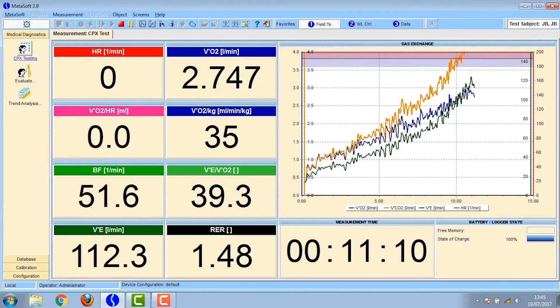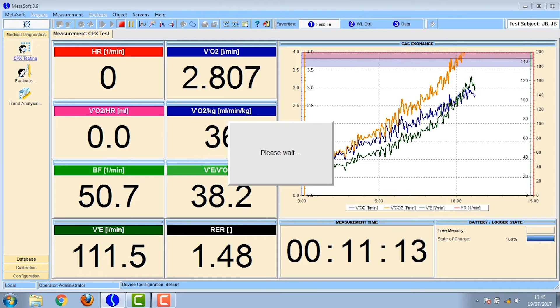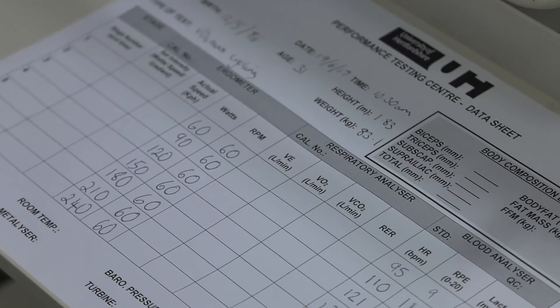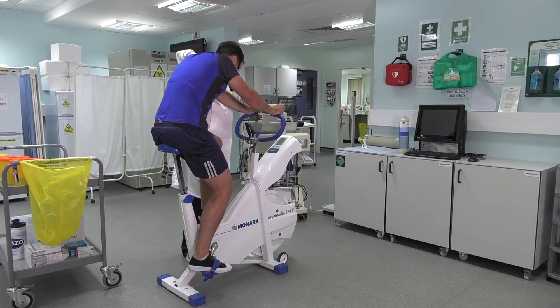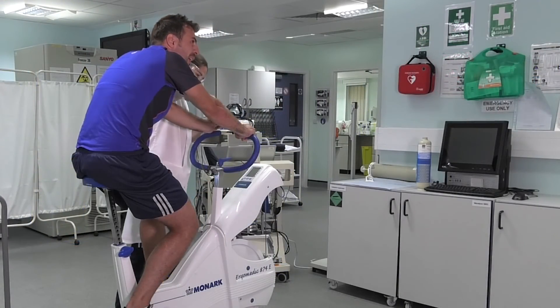You can see on the screen that the gases have all increased and it's getting close to completion. Once you've finished, press the red stop button at the top and the test is completed. Make sure you take the mask off the participant quite quickly so they can breathe and help them recover, then get them to start pedalling gently to cool down once you've collected your blood sample.